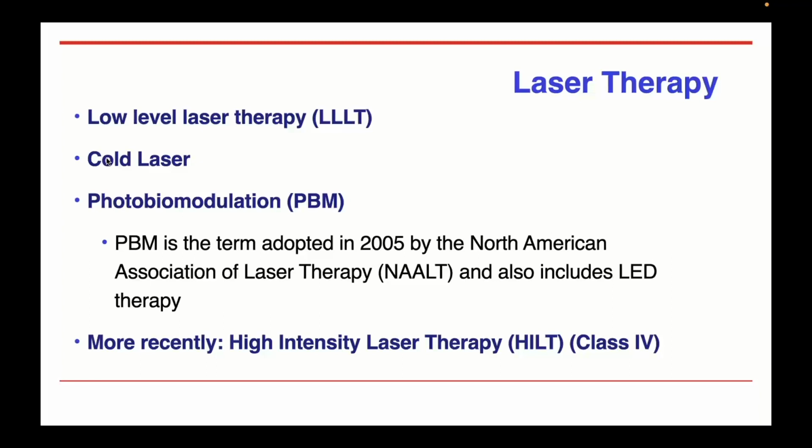So for skin conditions, they are interesting, but the penetration ability is very different in LEDs and lasers. And more recently, with the increase in availability of high power lasers, of Class 4 lasers, some prefer to use the term high-intensity laser therapy to differentiate it from laser therapy that is performed with lower power devices.